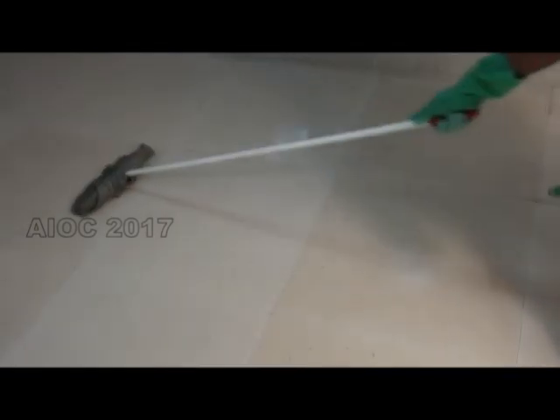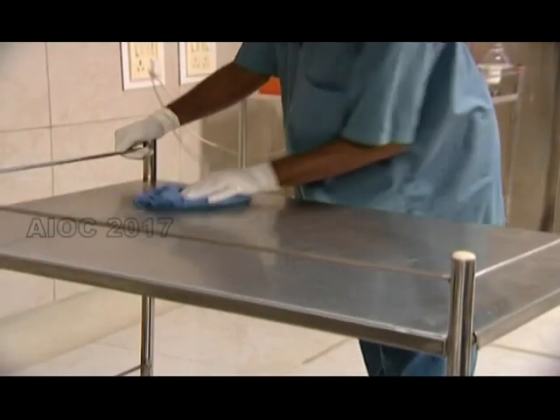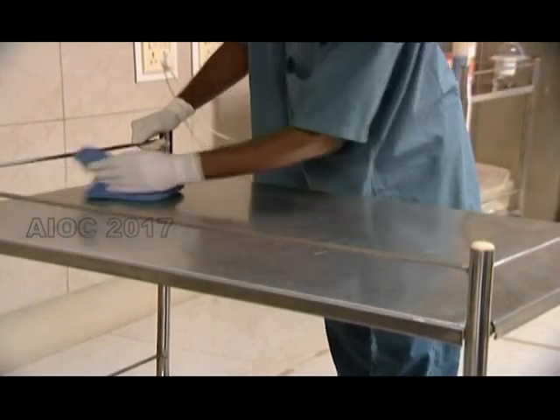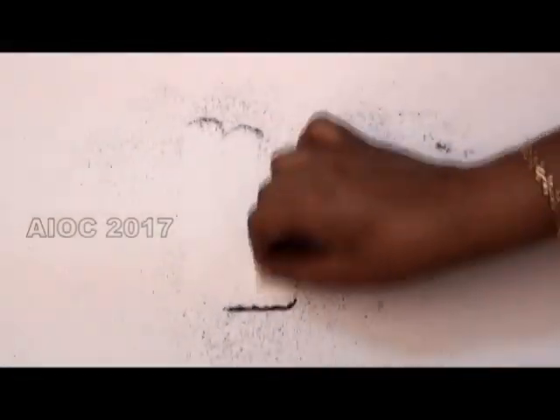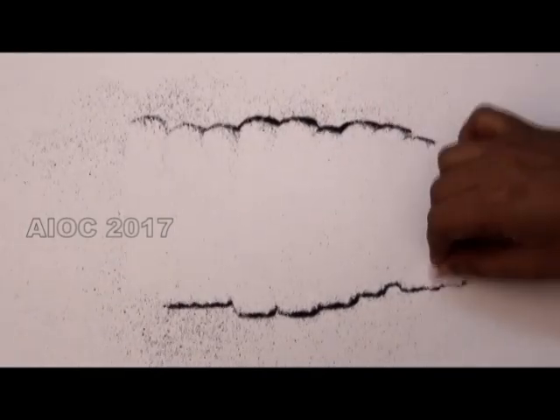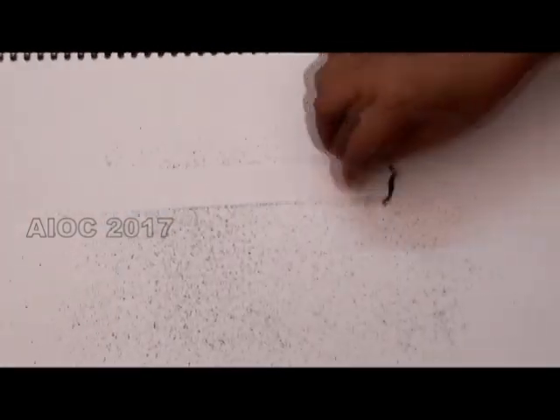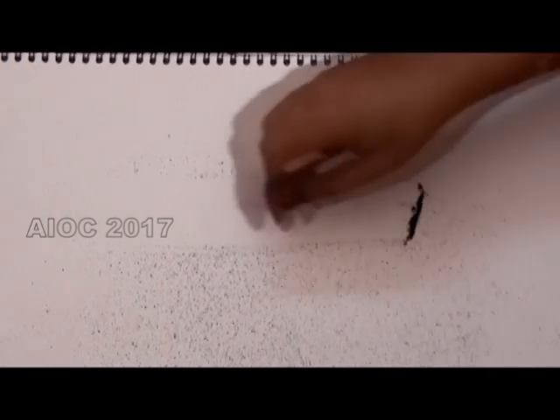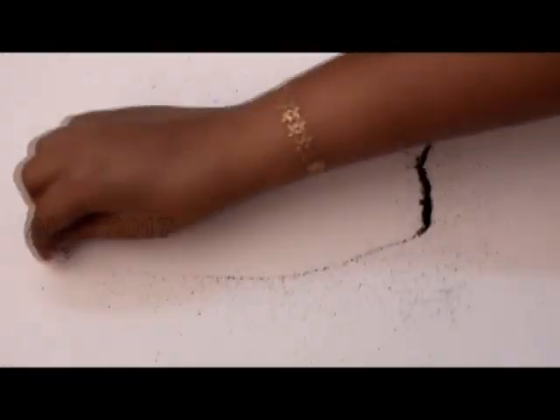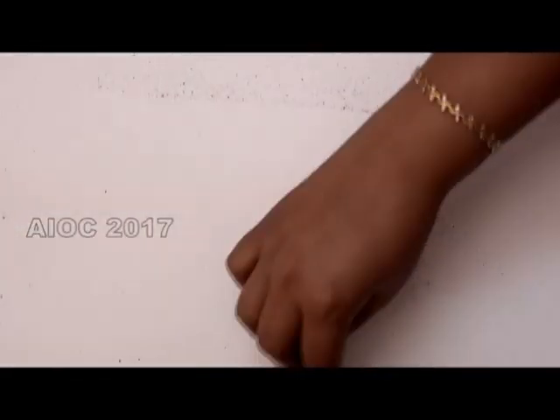Cleaning the floor should never be done in a multi-directional manner as demonstrated. It should be done unidirectionally so that you accumulate all the dust to one point from where it can be removed. This is the wrong way to wipe the tray; unidirectional is the best method. This is being demonstrated using tea dust.